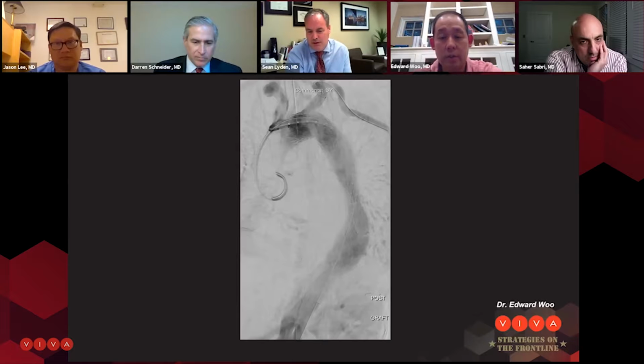But there are two really key points. One, you stayed away from the end of this device and you didn't go up proximally, because I think all of us early in our learning curves did it down distally and created a new entry distally, and we've all done it proximally and created a retrograde type A. Yep. Yeah, that's a real nice demonstration of that technique.